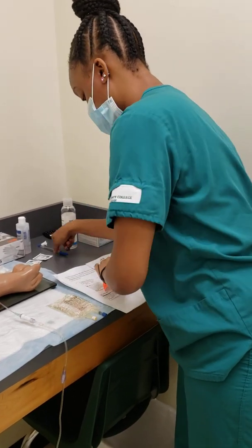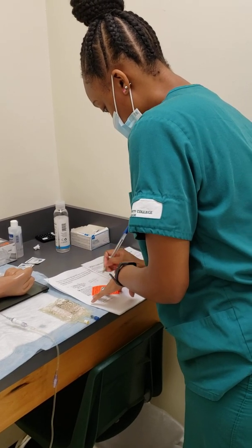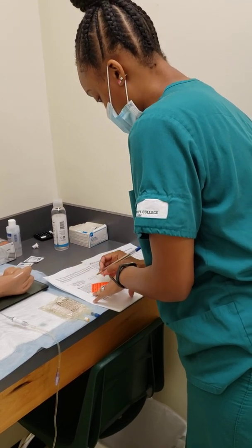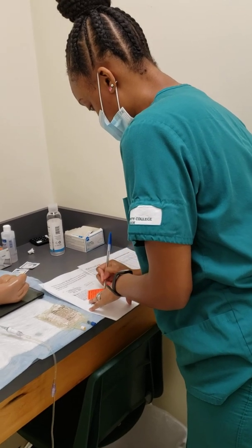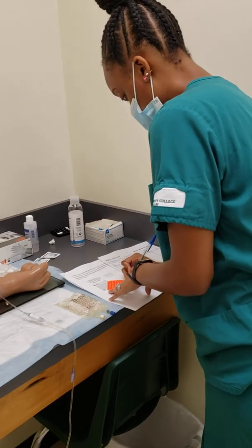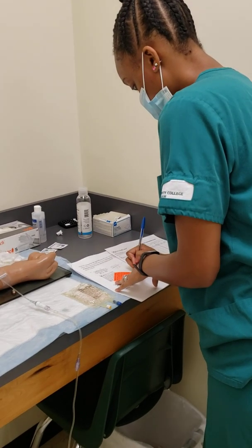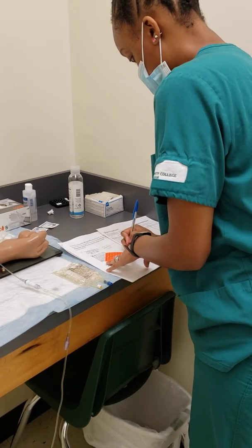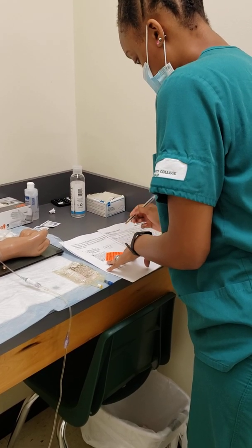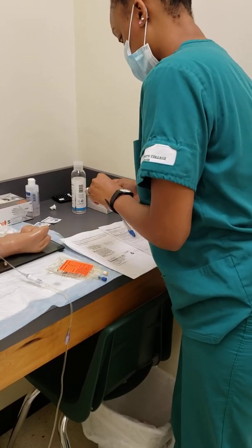And I'm going to go ahead and fill out my label, and we're going to put who it's prepared by, which is me, and we're going to put my patient's name. And I did notice that the medication was not expired, so I'm going to put the expiration date on here and today's date and our time. Okay, patient's room number. Okay, and it's prepared by me, and we have gentamicin. Okay, and it comes in a 50. The solution is 50 milliliters. Okay. All right, so we're going to go ahead and put this label on my solution.